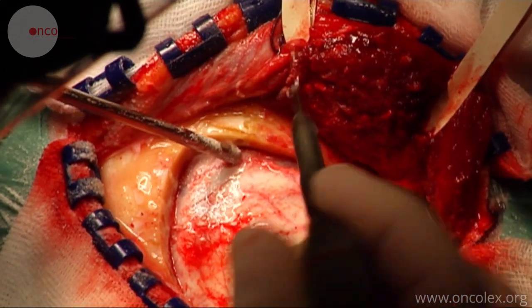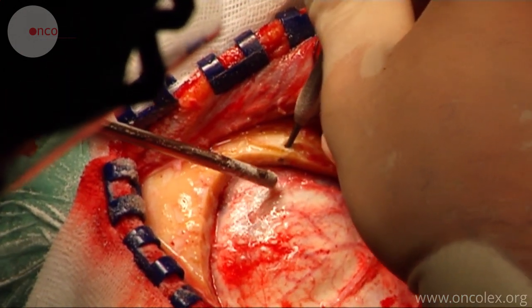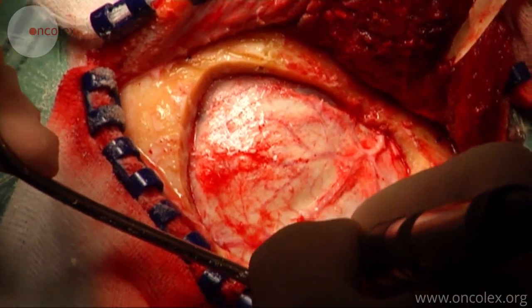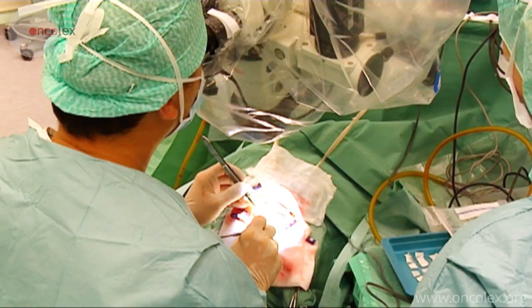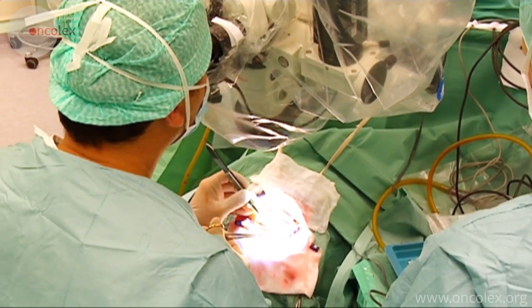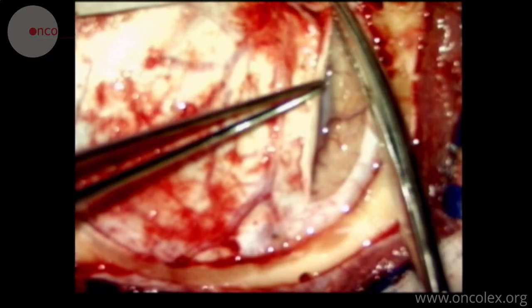A hole is drilled in the bone edge; this will be used to secure the dura at the end of the procedure. An operating microscope is used for the brain dissection. The dura mater is opened.